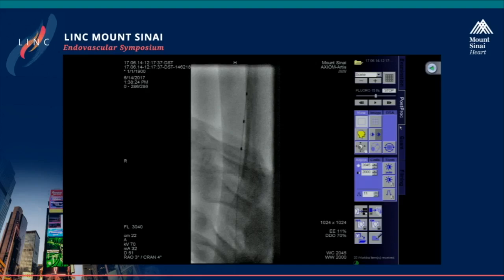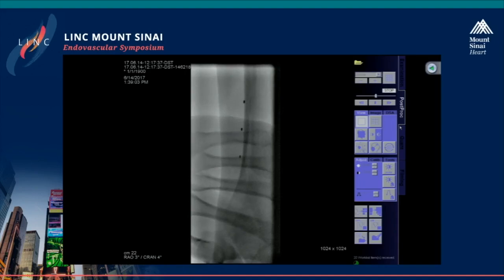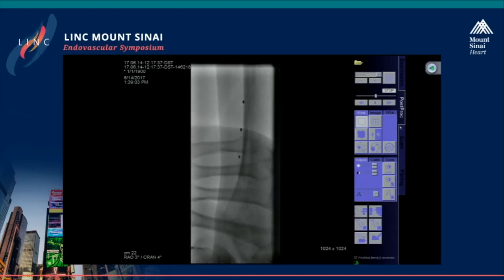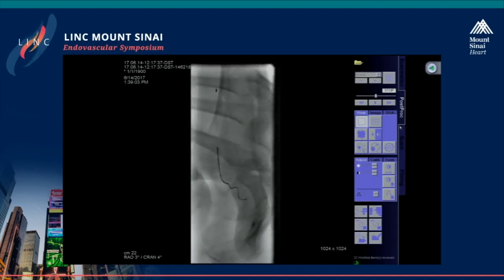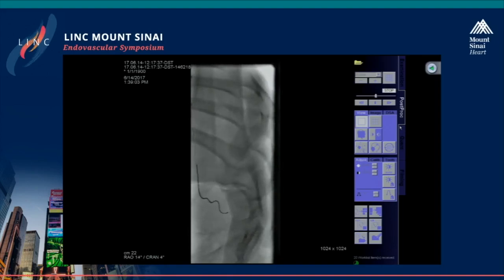I think what would be good to discuss, and what you mentioned, Kuhn, is should we consider adjuncts to improve the patency of a single vessel runoff, a large dominant vessel, in a patient who is likely to survive for a decent amount of time? And what are the options available in the US here, Brian? What's available for below the knee? Angioplasty. Are we in the right vessel? Yeah, show me that. Do you think a bullfrog would, in this case, be possible?